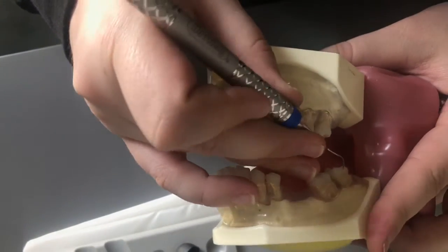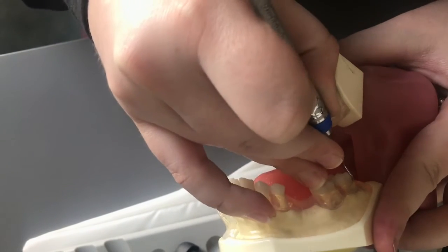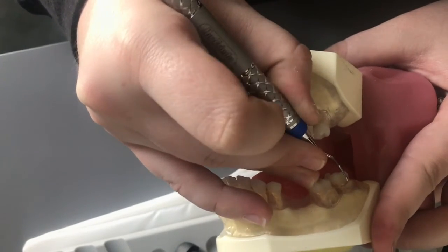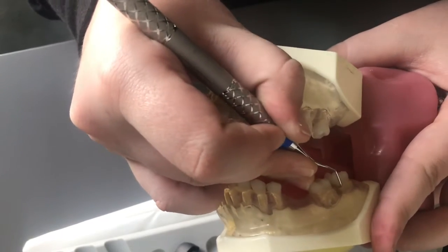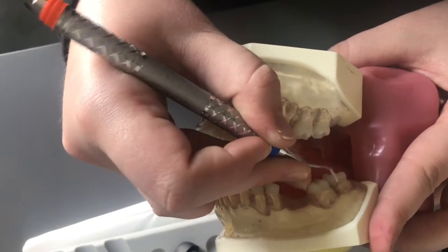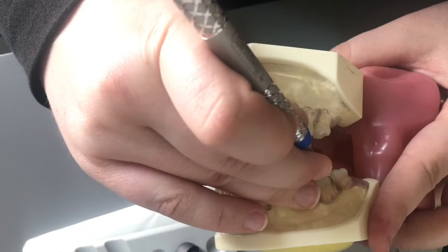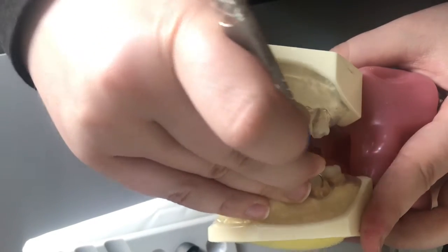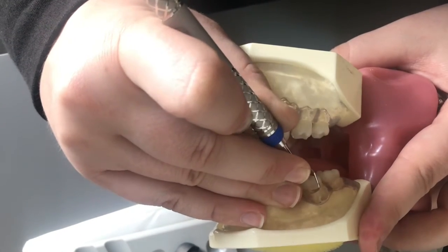So just like how we did on the maxillary, we want to make sure that our blade is closed and then open it once we're in the sulcus. Keeping that terminal shank parallel to the tooth. Again, we're going to start by that distofacial line angle now. Open our blade, roll, roll, roll.